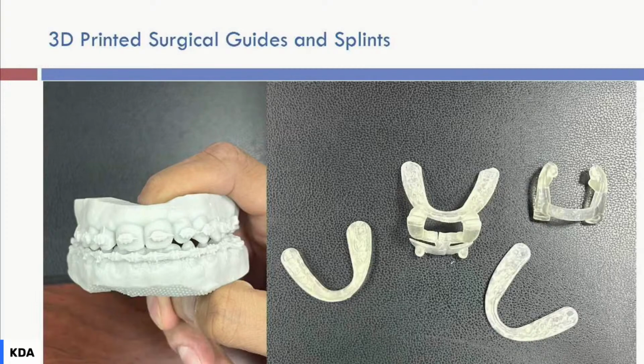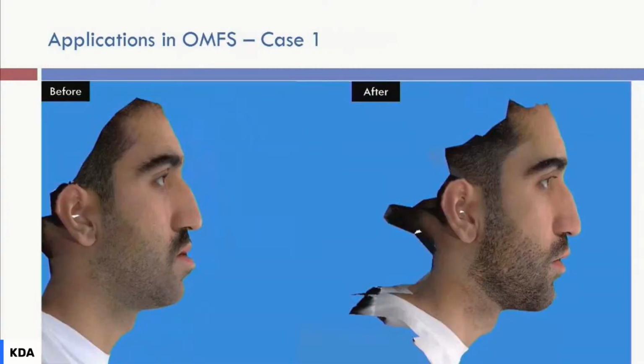And here I have something interesting. I designed a plastic model that goes on top of the splint, in which I can cut for this genioplasty. You can do the osteotomy, the cutting guide for osteotomy. During surgery, you put it on top of the splint in the patient's mouth. You rely on the position of the teeth and predict how you're going to cut, and it actually guides you how to cut. Here, for example, we want a 3 millimeter impaction, so you make 2 cuts according to the guide to make the osteotomies at the right level.